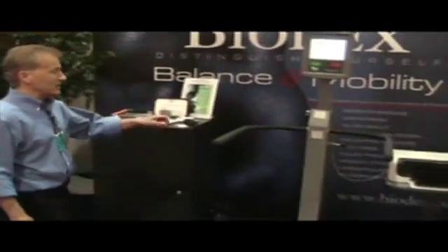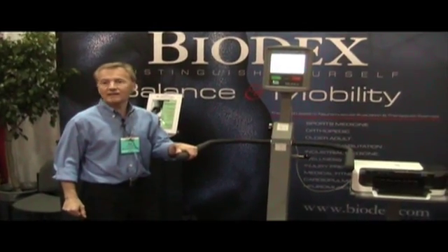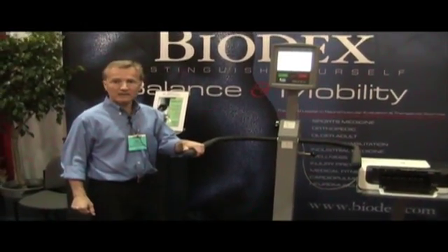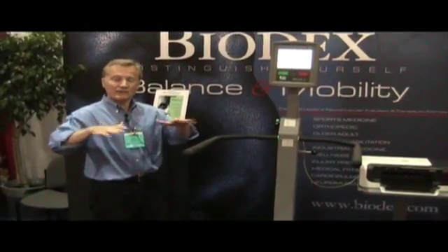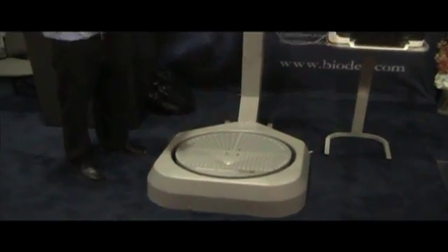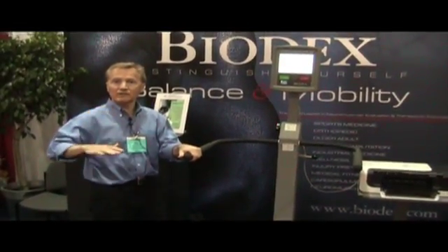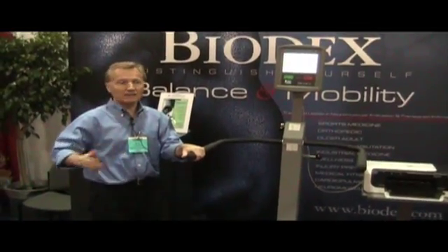This particular machine can test balance and train balance in both a static and dynamic environment. Statically, the platform is locked and we measure center of pressure and sway. In a dynamic mode, there are 12 different levels of resistance of the platform that we can set, making the platform very stiff and easy or very loose and very difficult to maintain balance.